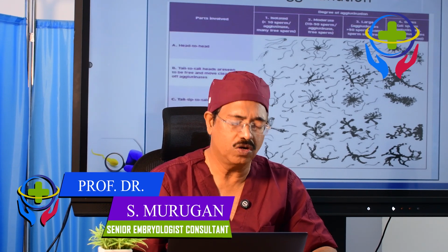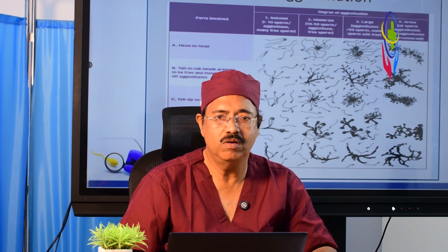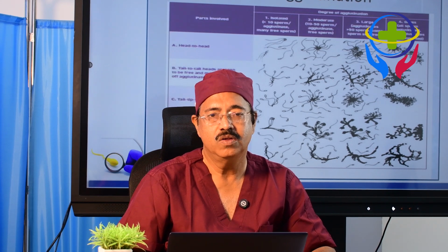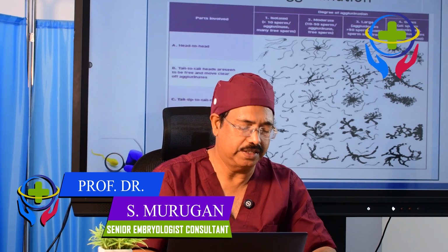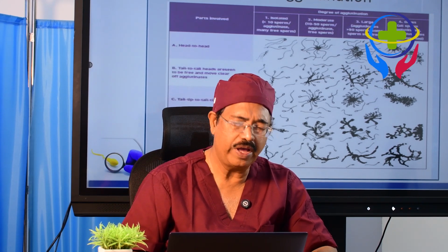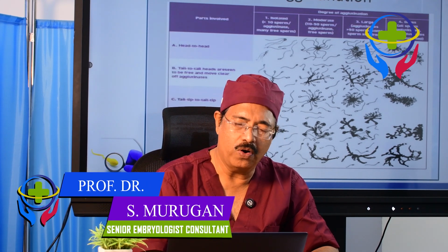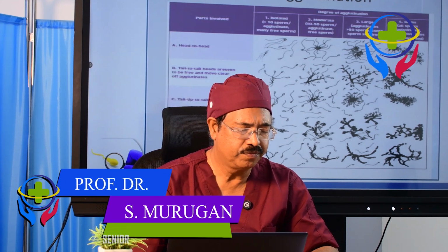And there is gross agglutination where we can't see any sperm moving in the field, and all the sperm are attached or agglutinated together. In this condition we can give grade 4 or 4 plus. So, we have 4 grades: isolated, moderate, large and gross sperm agglutination.